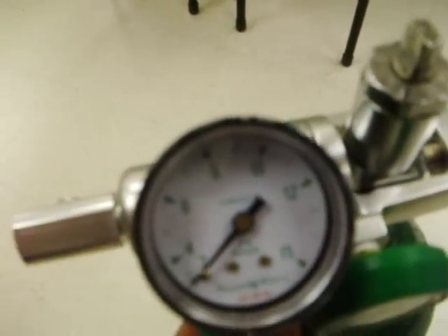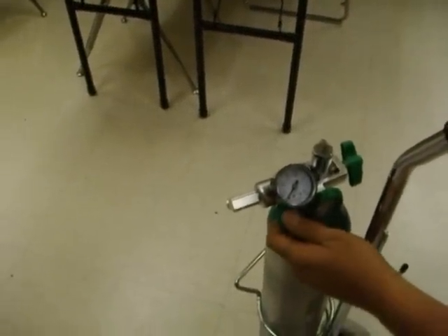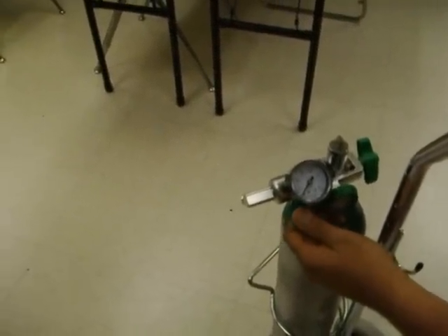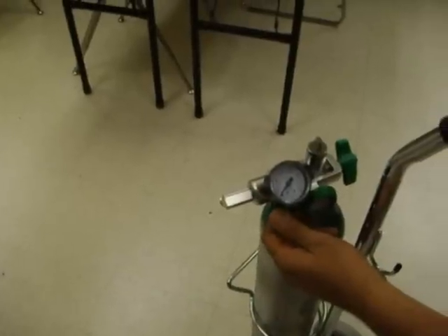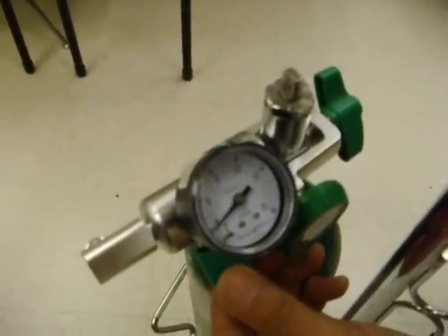Our doctor's orders prescribe a 4 liter per minute flow rate. Being that we're using a Bourdon gauge, we're going to turn the knob, which increases the pressure against the orifice and the gauge, which provides our flow. You can see it going up to 2, about 3, and there's our flow of 4 liters per minute for our patient.